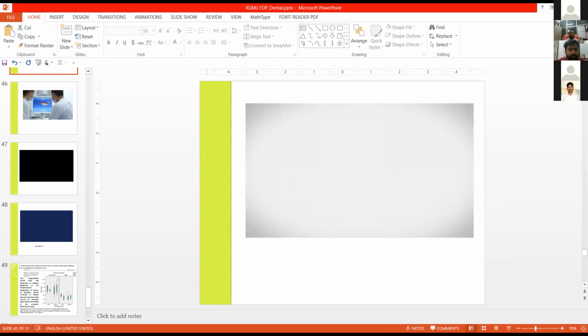We have gagging, we have dragging, we have pores, and then we have to pour it on the model. So in two ways we are increasing the inaccuracies on the model. And then the lab scanner, with whatever technology we have on it, we cover up those things. The lab scanner will capture the outer surface of the model. Then we get a digital model. So from there, I would like to start.